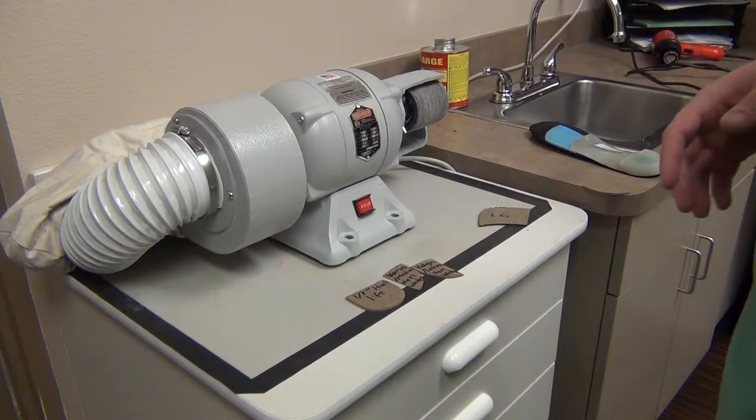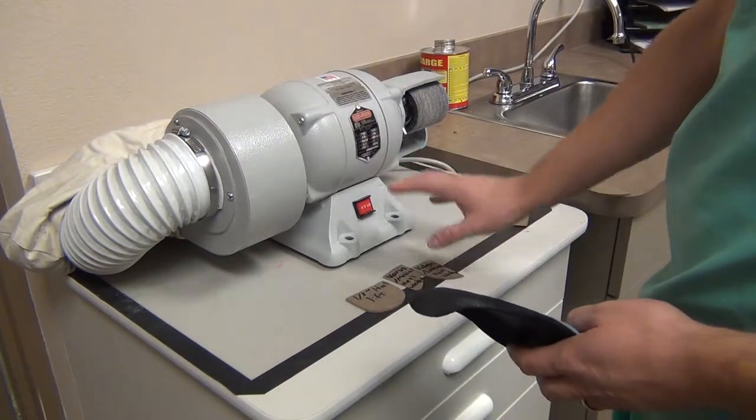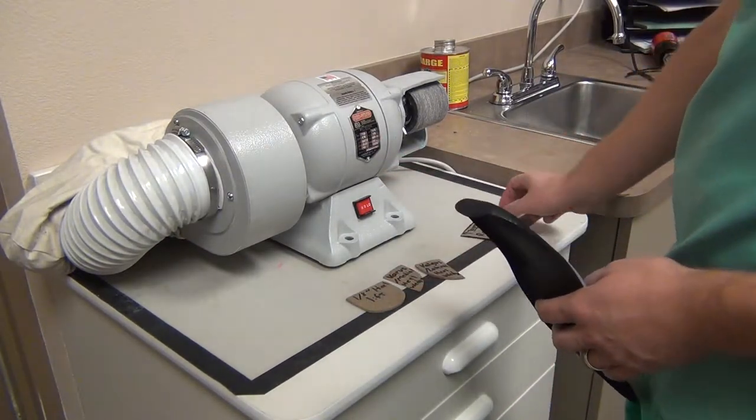In this second video of two on modifications to orthotics, we're going to talk about applying heel lifts, wedges to the backs of the heels, as well as reverse Morton's extension to orthotics.